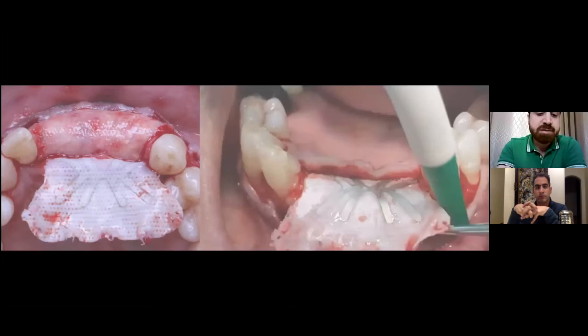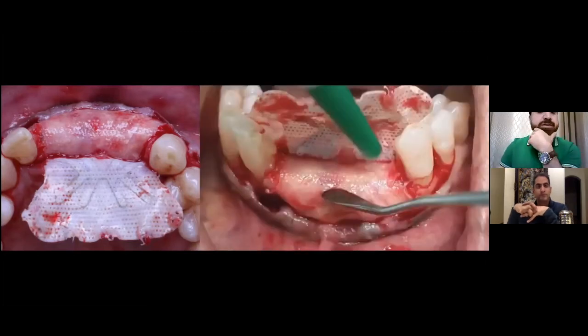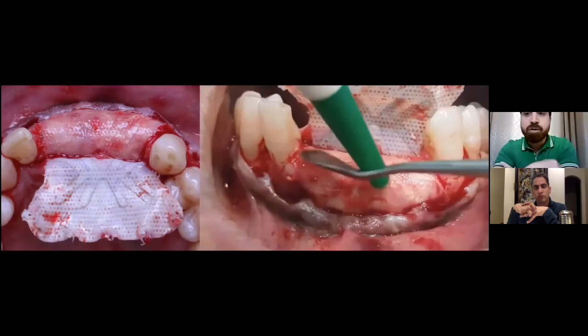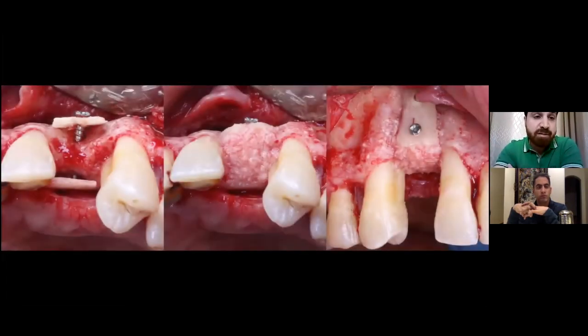On the other hand, when we're doing these surgeries, we can use non-resorbable membranes, titanium reinforced membranes. And you see here that when you tap on this bone, it's really hard bone that you're getting. It's mostly presented and shown in a very thick book by Professor Istvan Urban. It doesn't mean that GBRs cannot be done this way, but there are still some problems when you're doing these techniques, as well with the Khoury technique, here, for example, to augment on the palatal and on the buccal. The main issue that I face in my daily practice, or want to avoid, is complications.